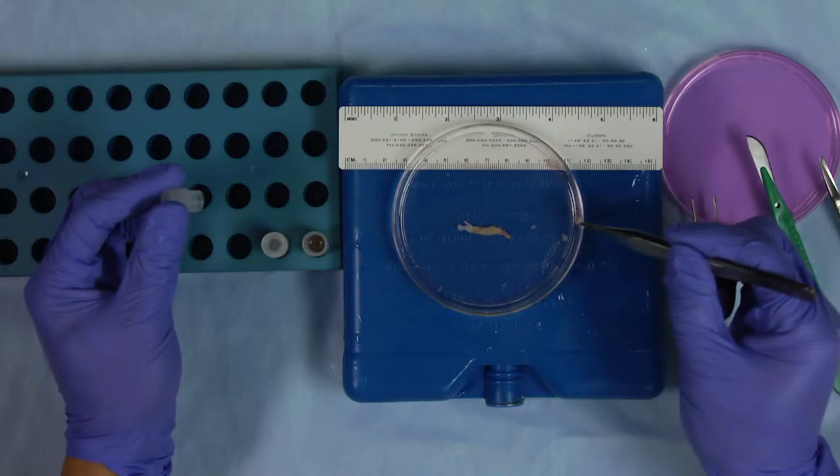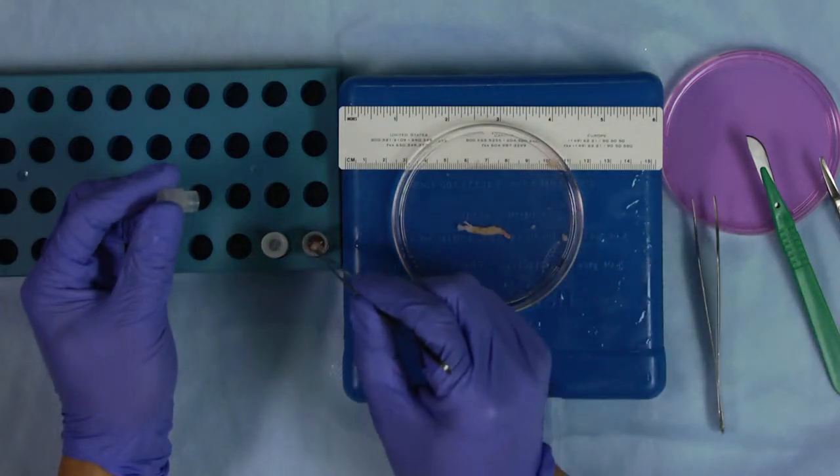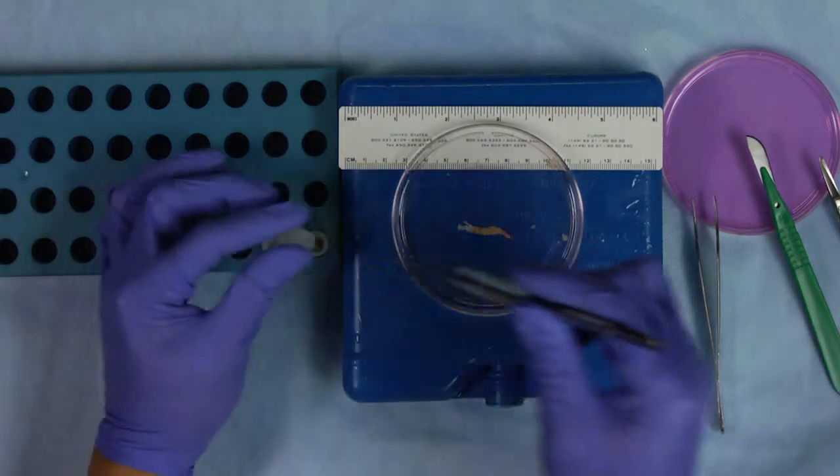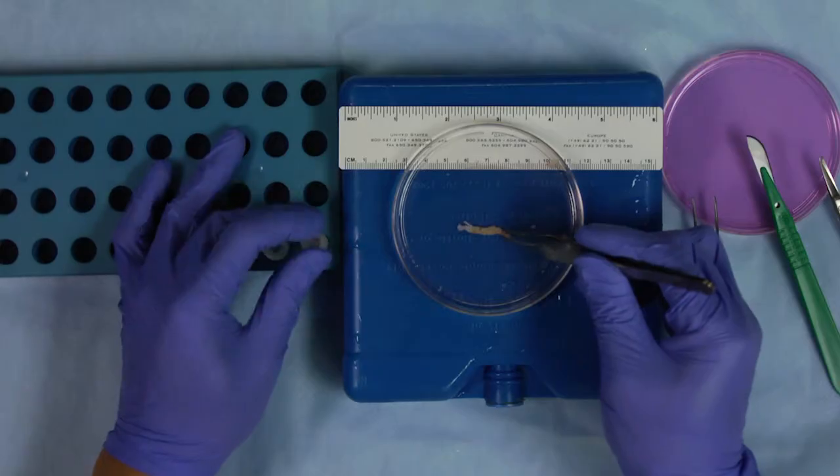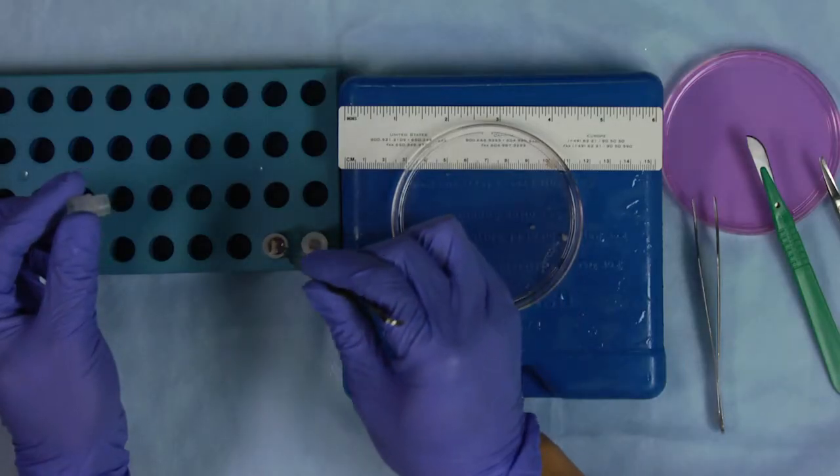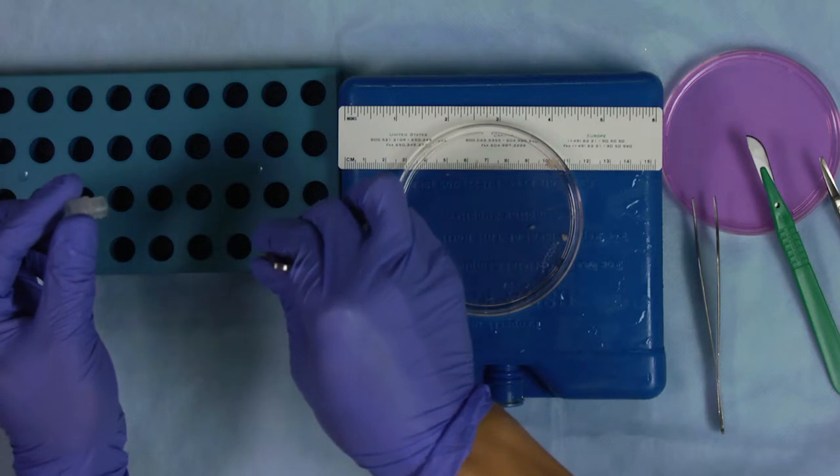For the patient tissue, transfer the tissue into cold cryomedia and gently shake for a few minutes. Load the tissue into the vials preloaded with 0.8 milliliters of cryomedia, approximately one to two pieces per vial following the protocol that's described in the NPC manual.